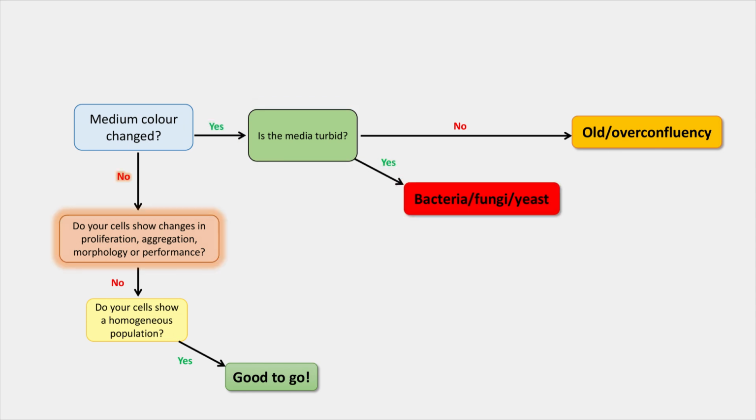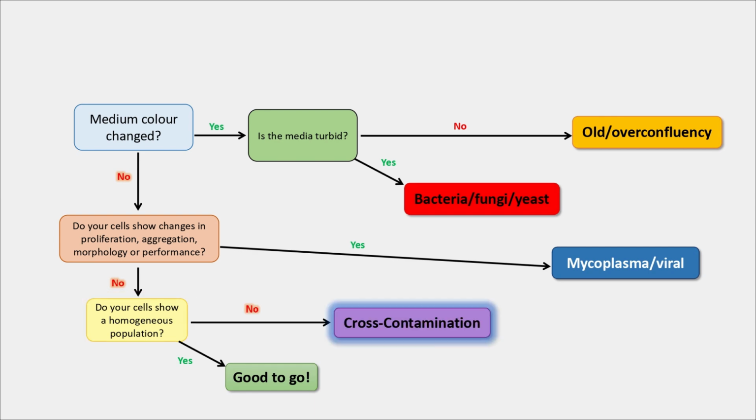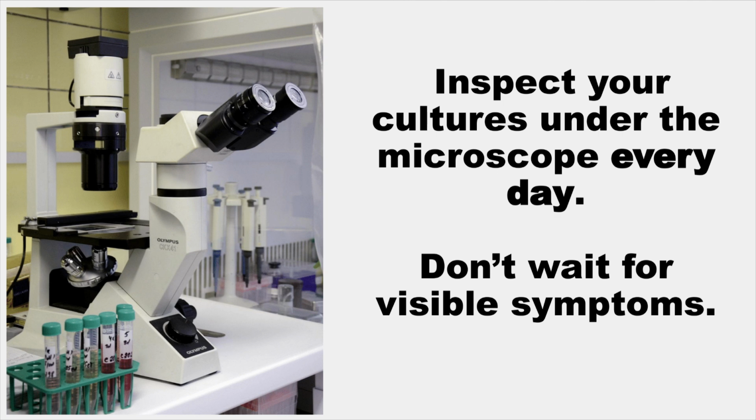No color change, but the cells show unusual morphology, behavior, and performance. That's likely mycoplasma or viral contamination. If the medium looks fine and the cells seem happy, but their shapes aren't consistent, that's a strong sign of cross-contamination. Your microscope is your first line of defense.